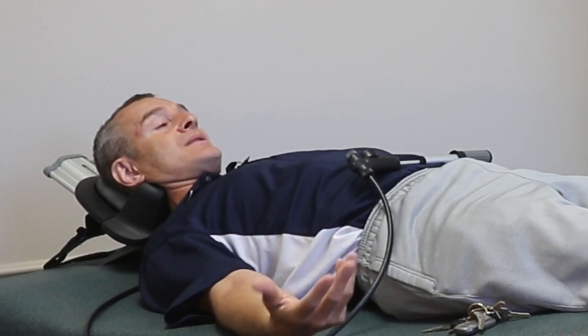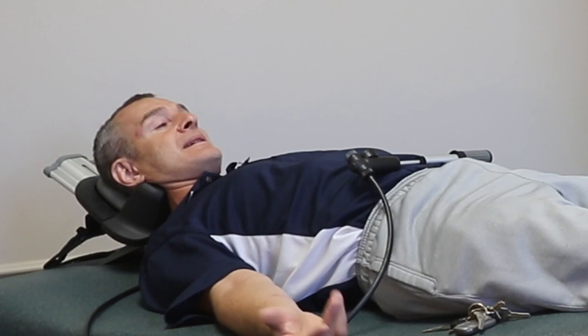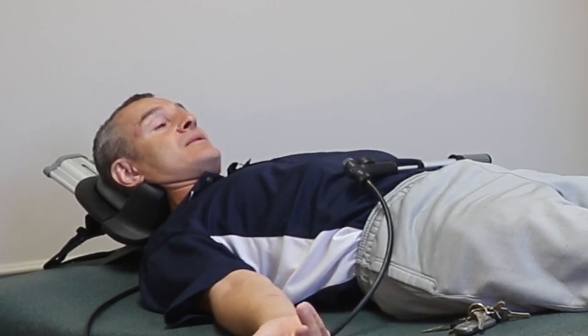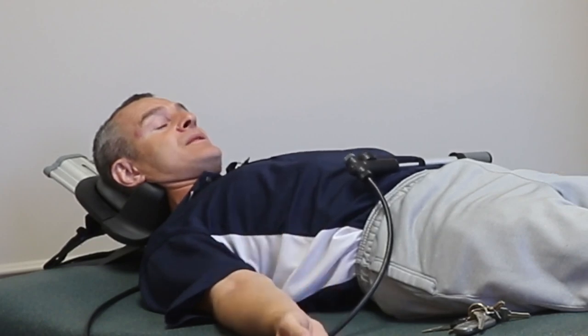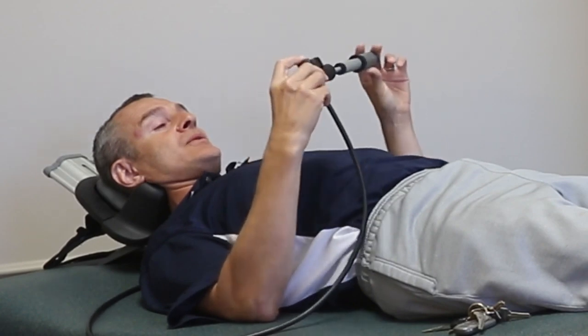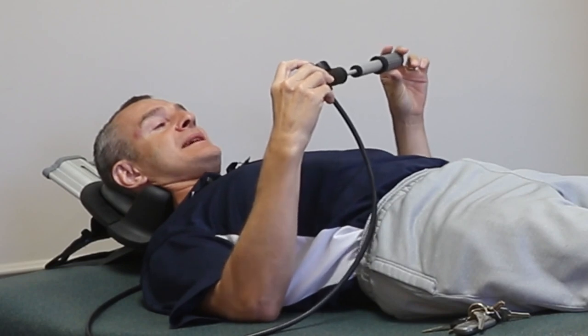I usually look for a 10 to 15 minute treatment episode. They're relaxed, they're comfortable, they're thinking about their day. Hopefully they're dozing off because they're so relaxed. And then at that point, when they're ready to end, I'll come over, we'll pick it up, we'll slowly, and you can just do that by controlling how much pressure, deflate.